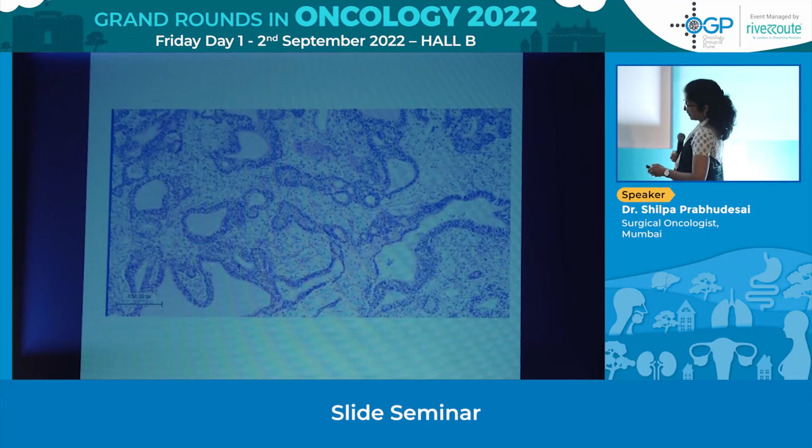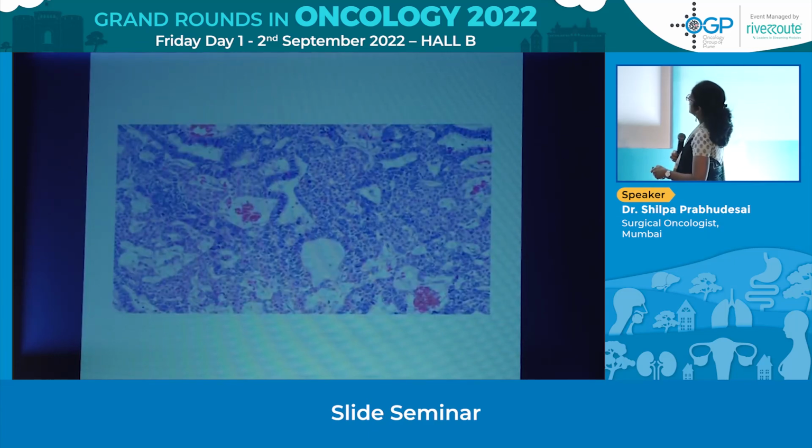The stroma appears fibroblastic, nothing very spectacular about the stroma, and this was an interesting feature. There were areas where amidst these other epithelial cells, we saw other cells which were smaller, cuboidal, and very monomorphic, regular looking, with a round nucleus, pale cytoplasm, very bland, and they were suddenly popping out in nodules.